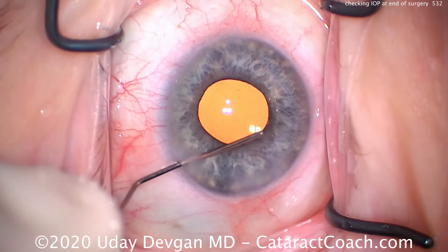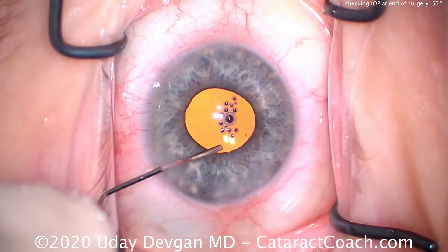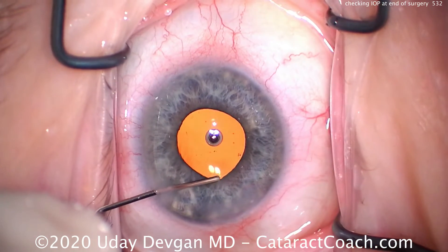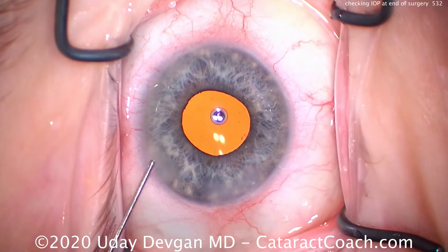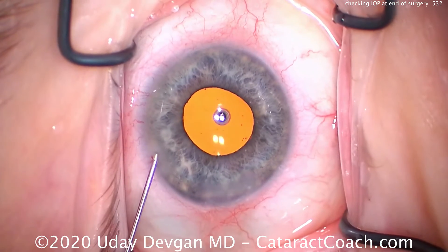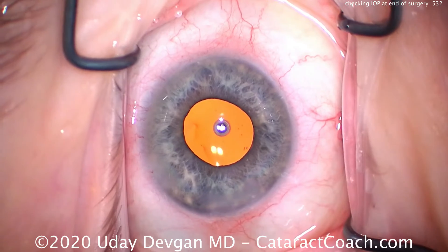A little sweep here in the anterior chamber, centering up the lens, making sure I'm happy. Everything looks good. My ideal pressure at the end of surgery is about 20 millimeters of mercury. If it's a little more, like 25, that's okay — but I want to avoid a very low pressure of less than 10 millimeters of mercury, and I want to avoid a very high pressure of more than 30.